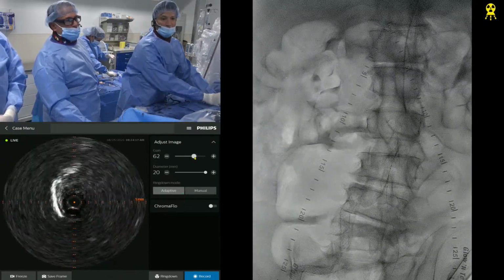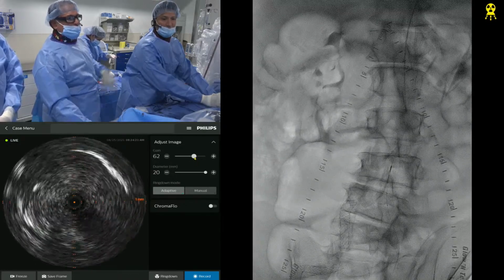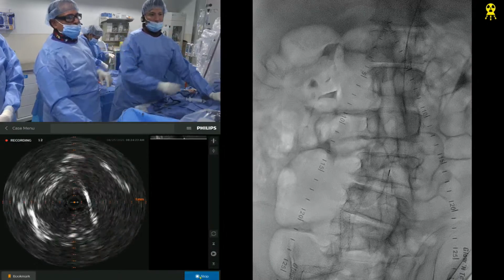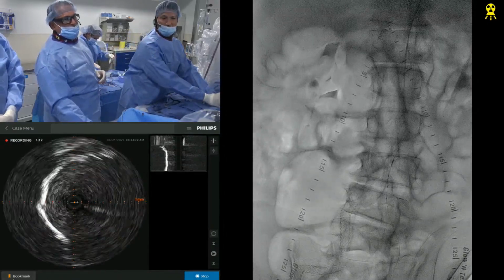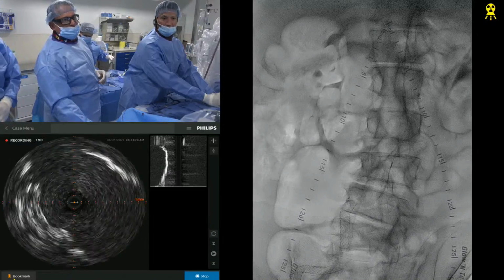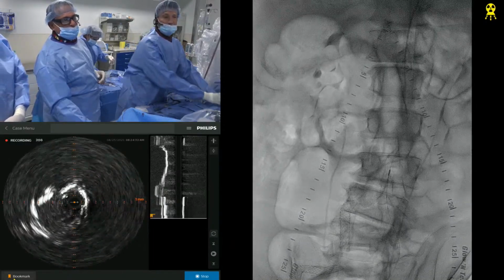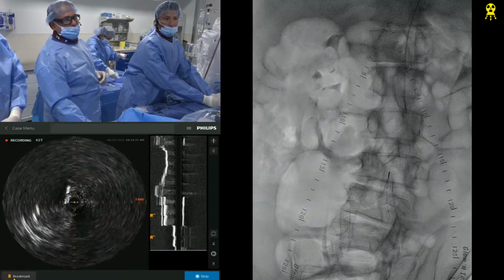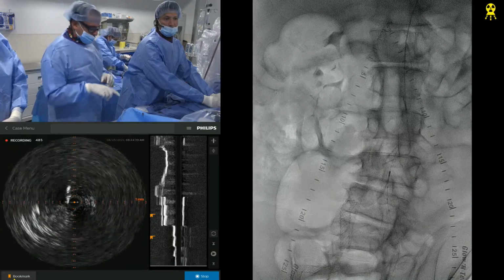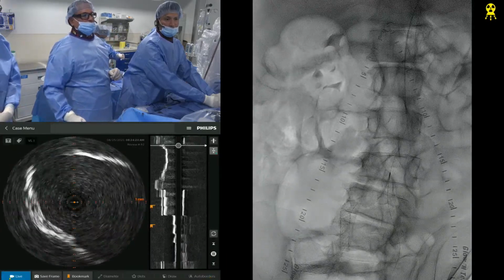That's an 014. That's the problem. Yeah. That's fine. I think we're okay. This is the aorta. We know that. No, stop. Go up, please. Good. Okay, record this, the aorta. Come down. So you can see here's the aorta still. Right, there's your iliac ostium that's very, very tight. Oh, so just actually below the ostium is really, really tight. So you know what? Let's go back up. Okay, stop it. Let's go back up a little bit.